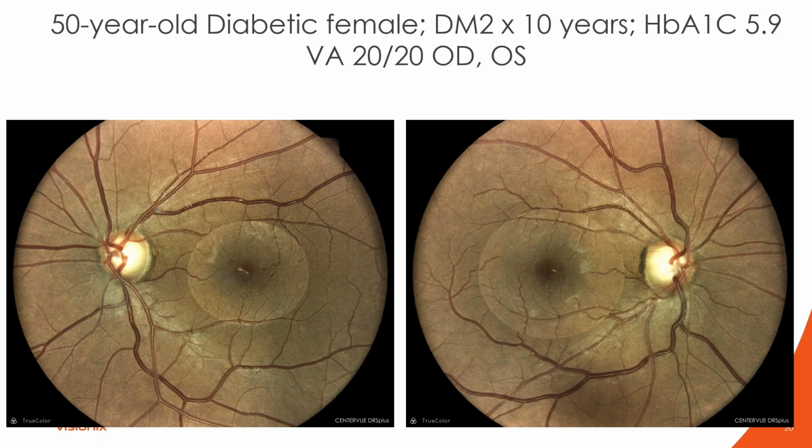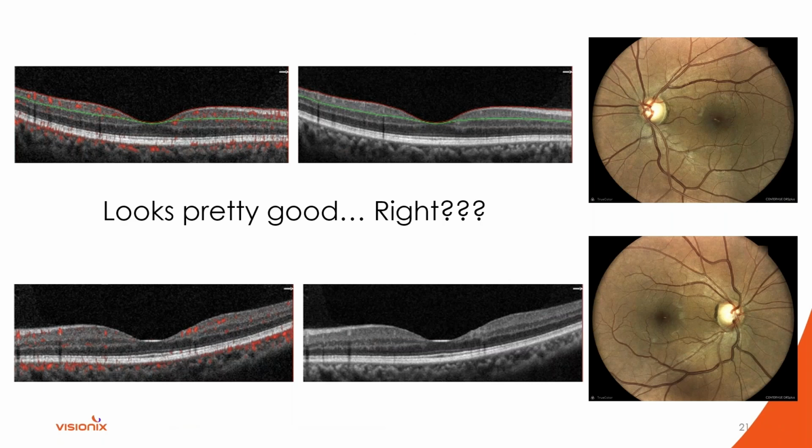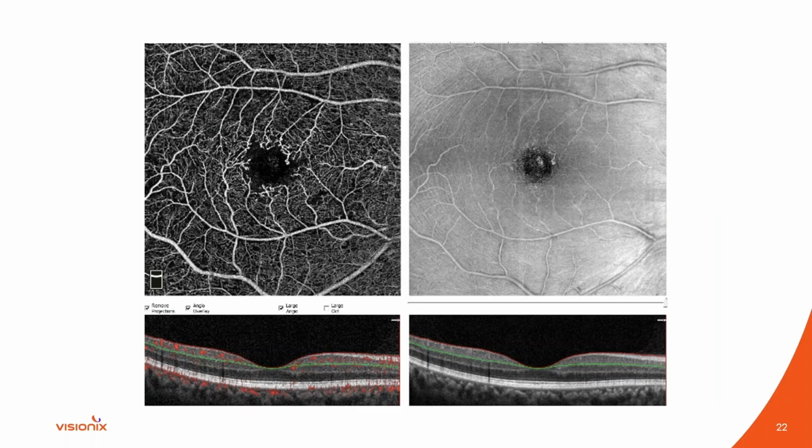I'm blowing up the maculas here because you're going to be quite shocked and surprised when I show those to you on angiography. But maybe if you're looking very closely, especially on that left eye, you may notice that there are some anomalous vessels. And here's the OCT scans not showing anything, right? Remember, from an anatomic standpoint, these B scans are normal. The fundus exam looks fairly normal.